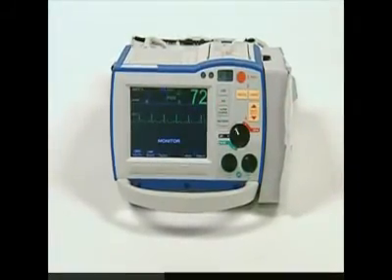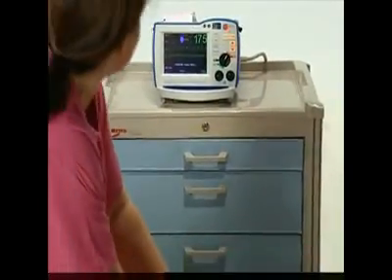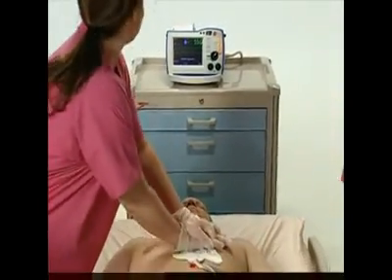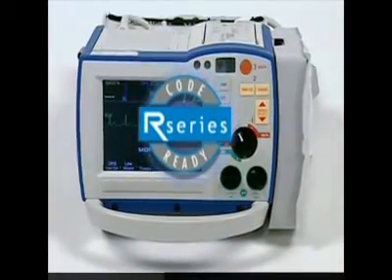As you can see, the device is simple to operate, smart in helping you quickly and properly treat the patient, and ready at all times for a code. Simple, smart, and ready. That's a code-ready defibrillator.